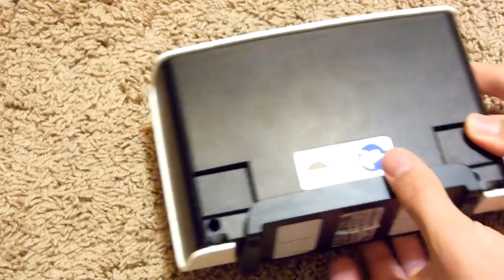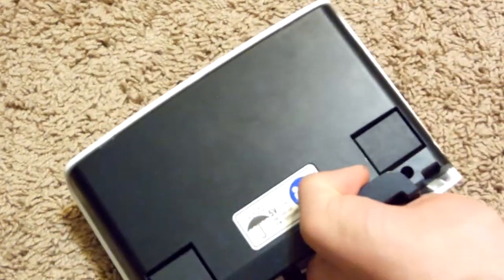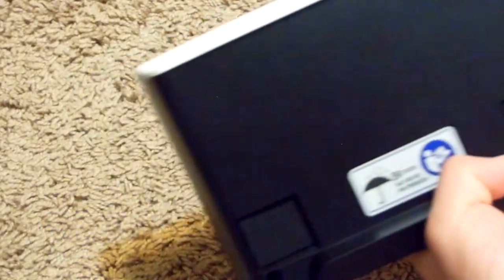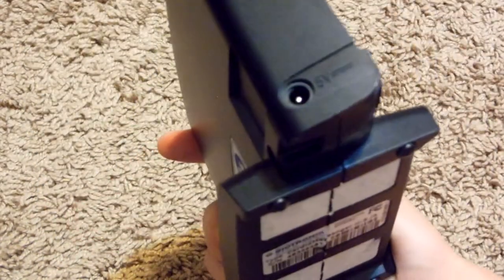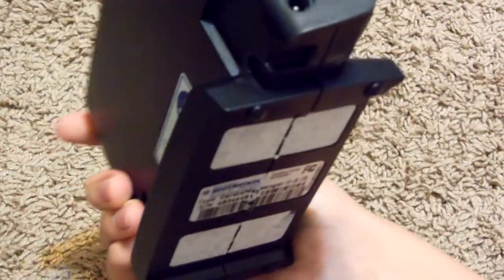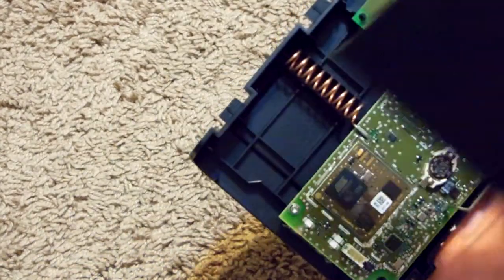Now we've got those two screws out. All we've got to do is depress on both of these tabs and pull up. Flipping to the other side — those two screws that we removed, that's actually a power input jack. Now that we've removed those two screws, this whole thing comes right apart. Just pull up and then out.